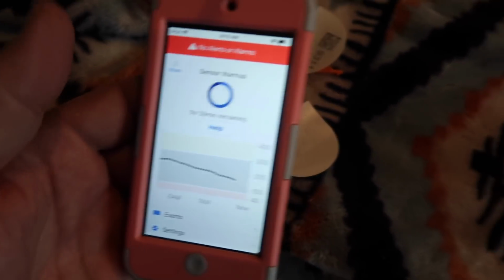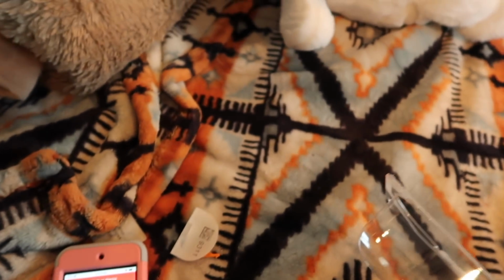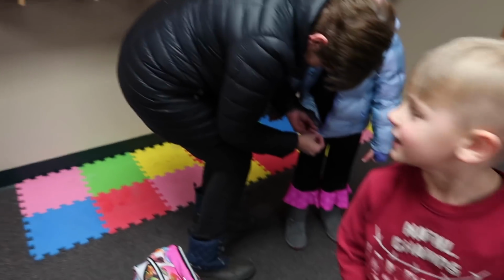Sensor warm up started, so should be successful. Excuse my hair, should be successful because we waited a good 10 to 15 minutes before starting the new one. So, there you go, get the kids off to the bus and take off to drop Grayson off for preschool and head to work. We're gonna go get Burger King.